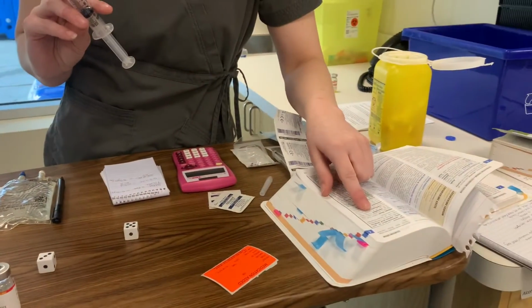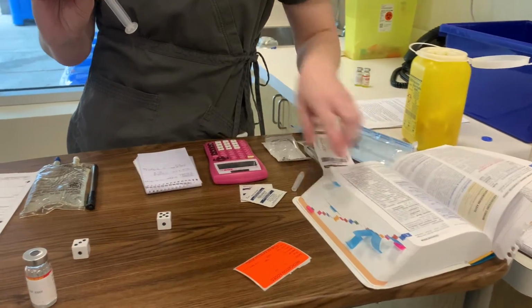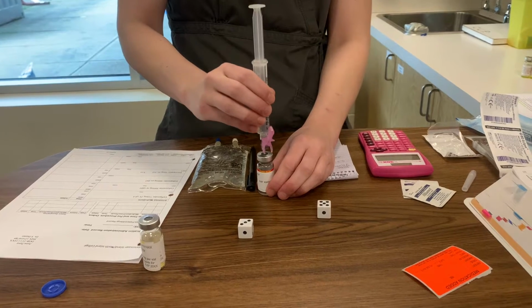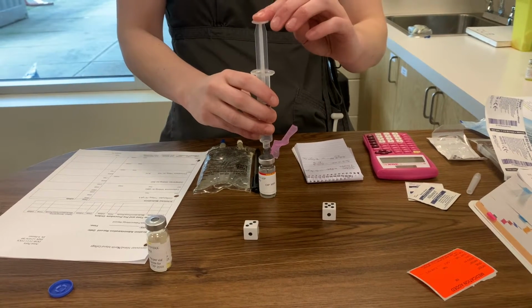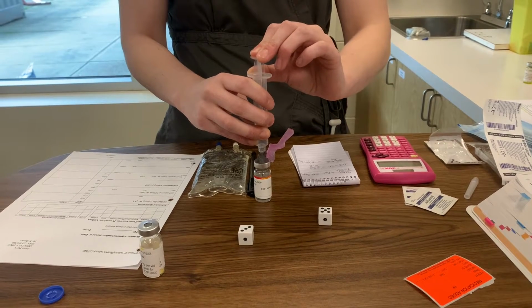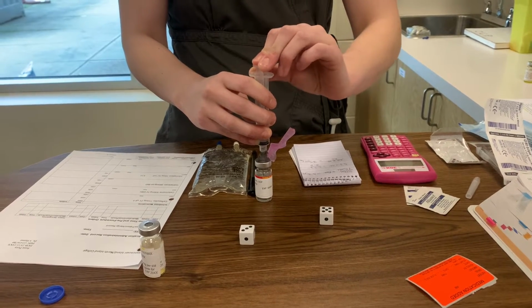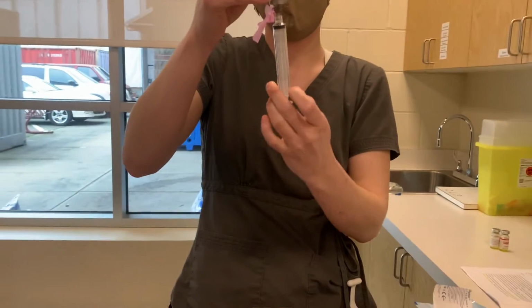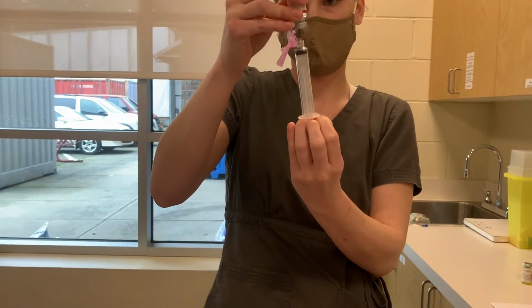Just going to confirm. Perfect. And then I'm going to invert it and get those 8 milliliters back with water.